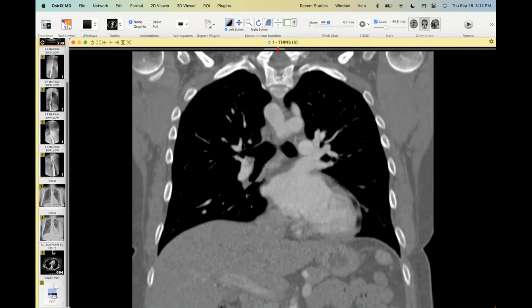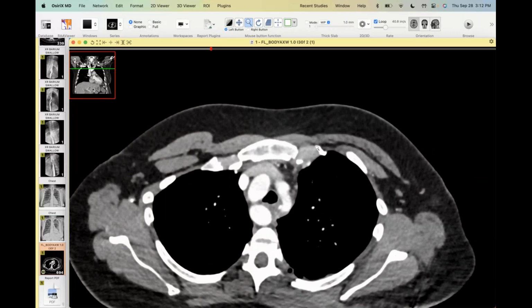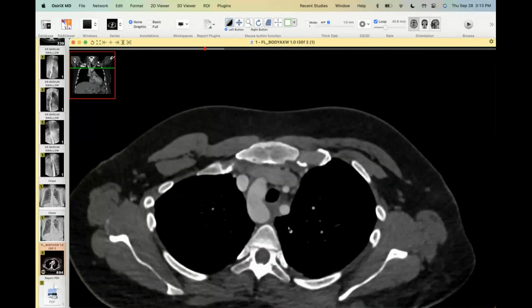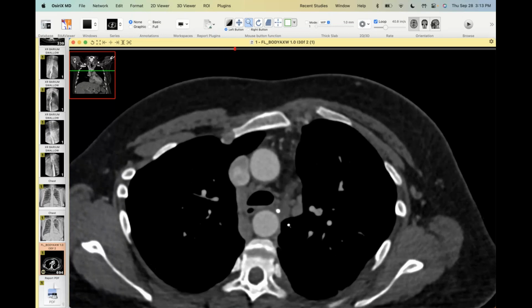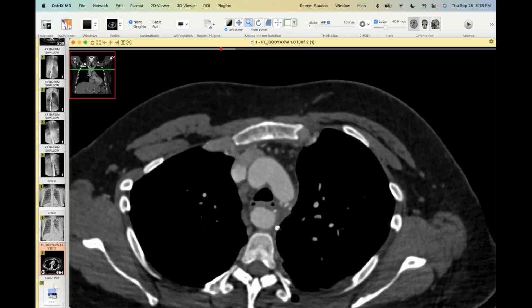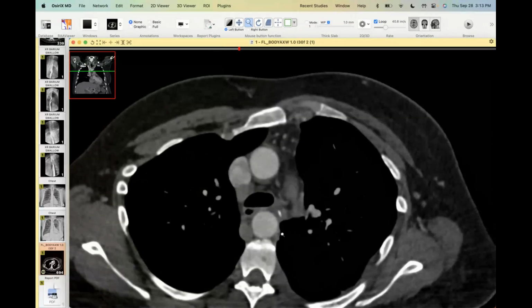And that's one of the reasons I wanted to show it, that they just ligated the left-sided arch. They didn't really have to do anything besides that. But you can see they ligated it posterior to the left subclavian artery, right there. And they also ligated her ductus or ligamentum arteriosum, but that wasn't really contributing to the vascular ring in this case. But her symptoms did improve. You can see there, I think there's always going to be a little bit of deformity of the trachea there, but her symptoms did improve with treatment of this.